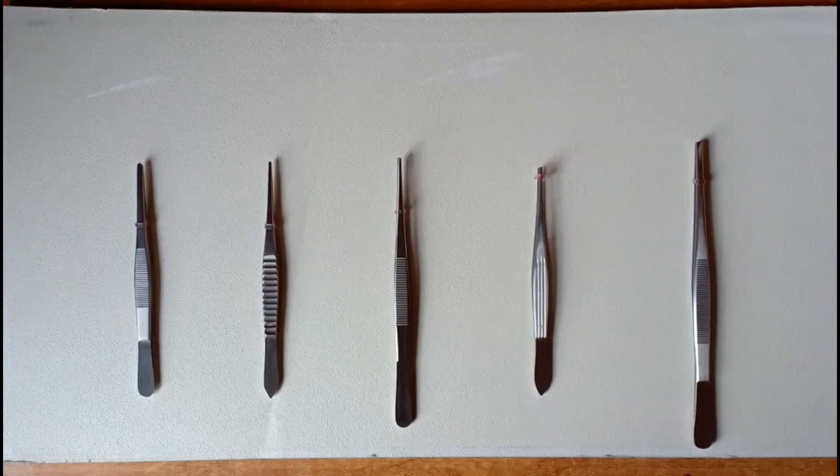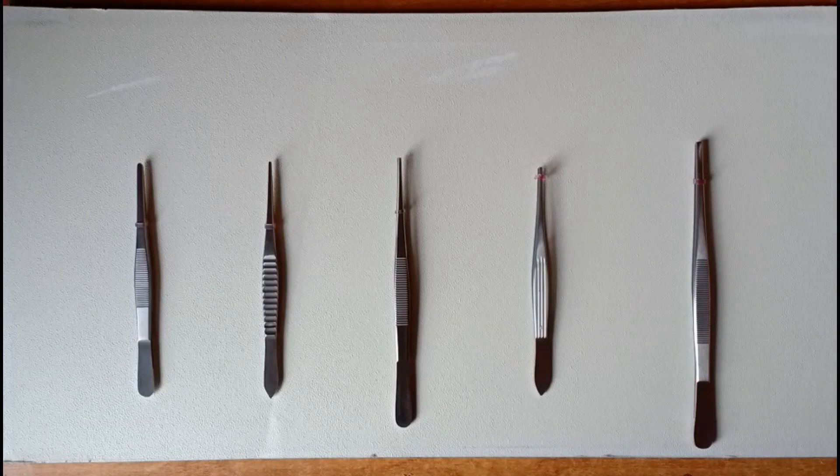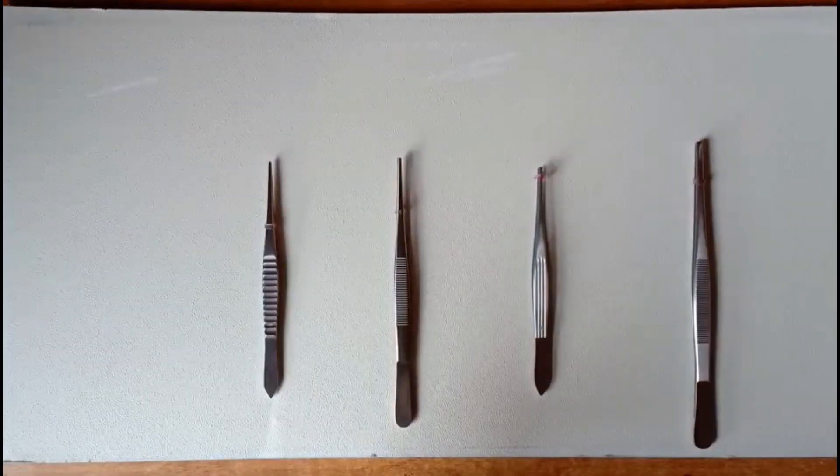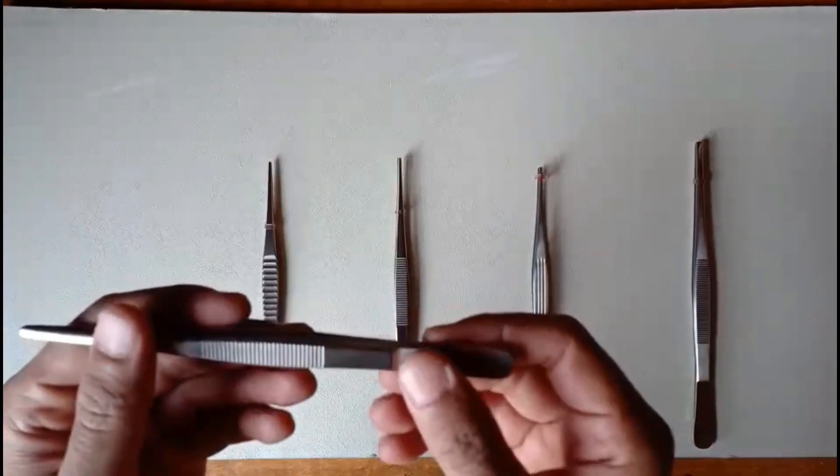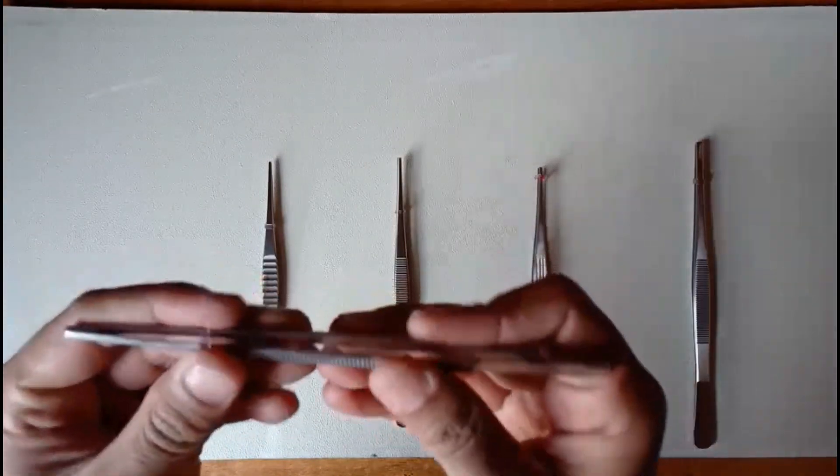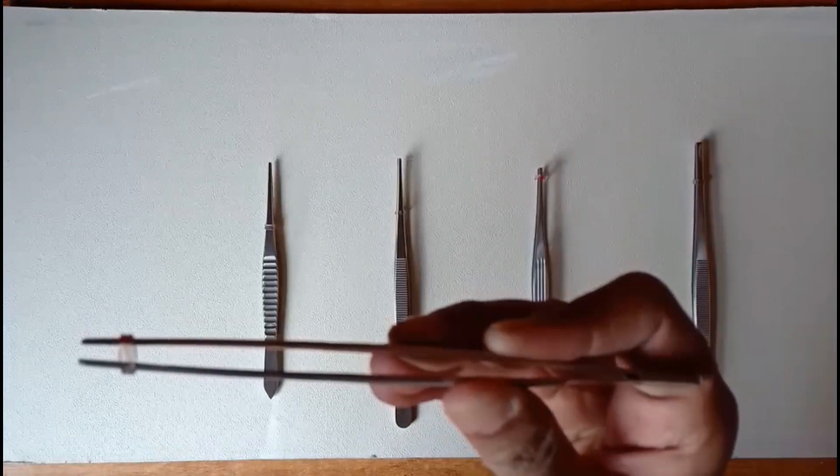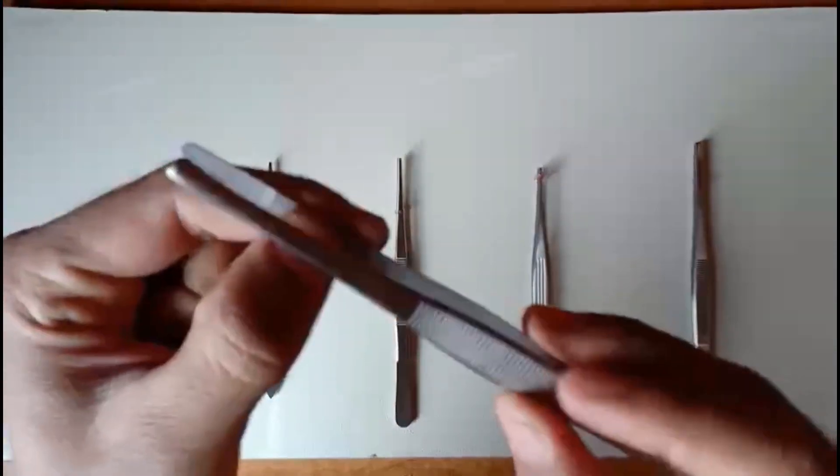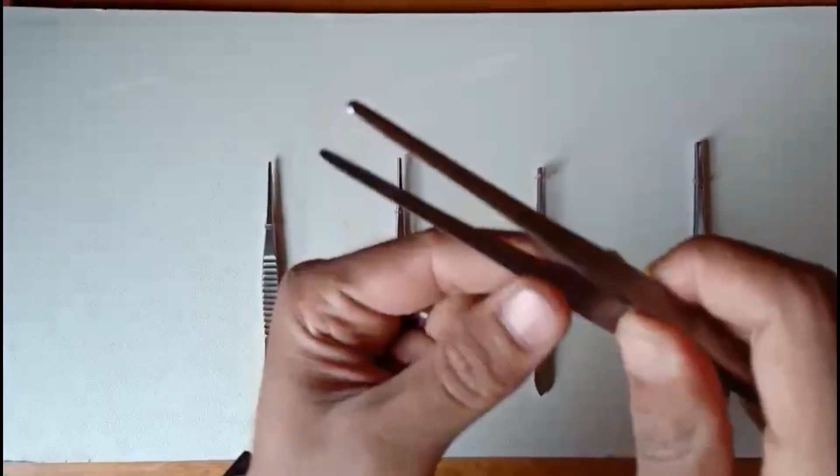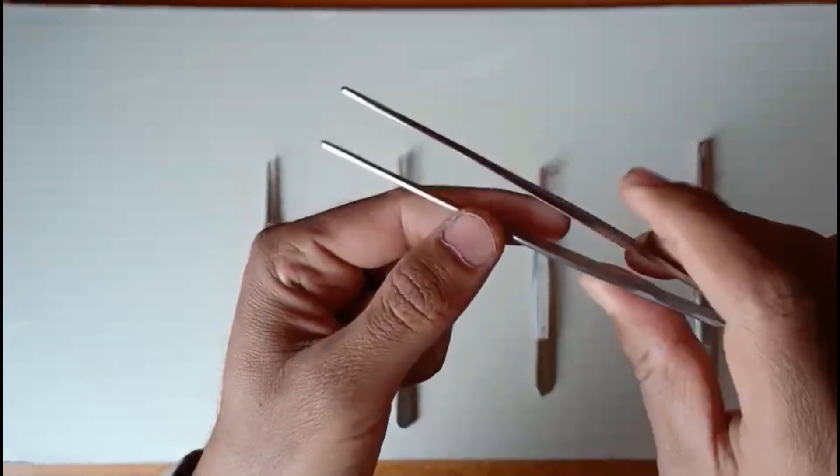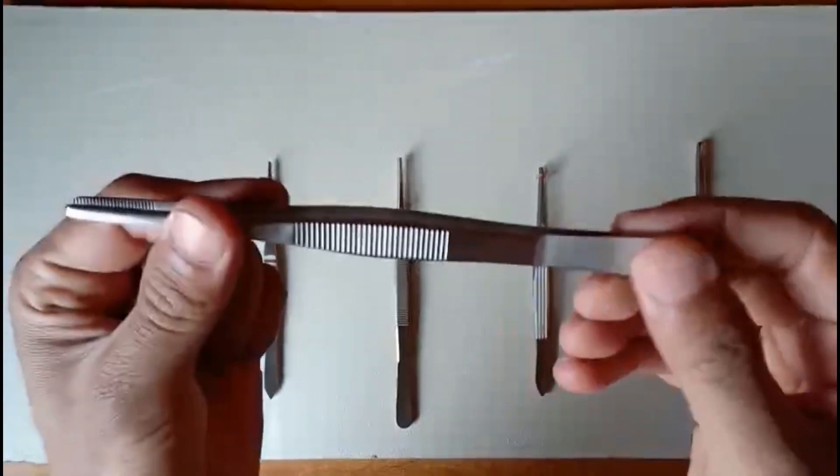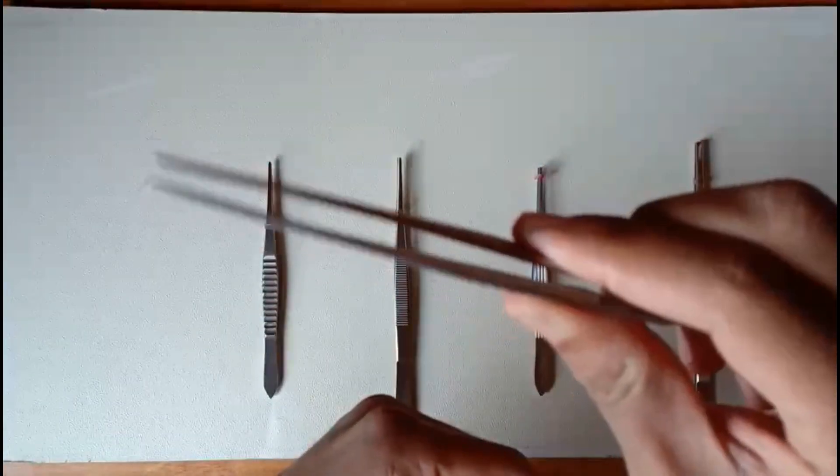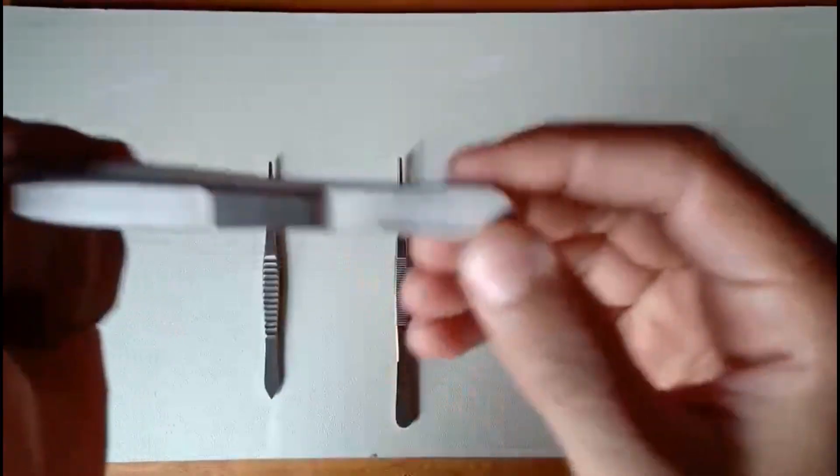You can find various types, qualities, and sizes. The first instrument I'm reviewing here is a standard pattern dissecting tissue forceps, made of high-grade stainless steel. You can check the serrations here, made of fine-grade material in the middle. The strength is very good.